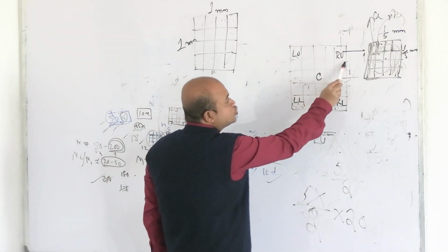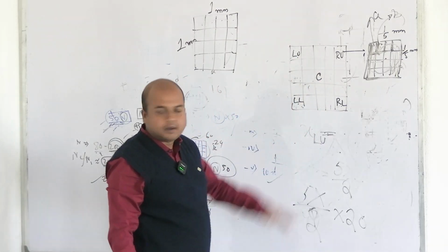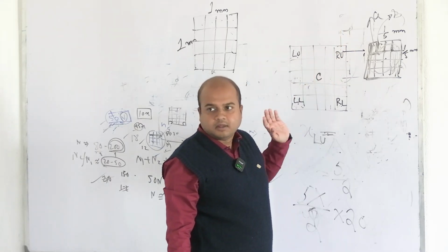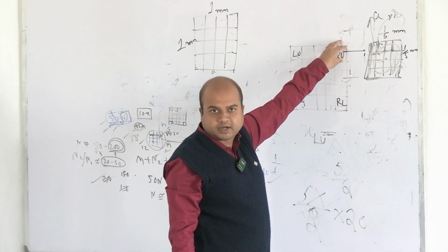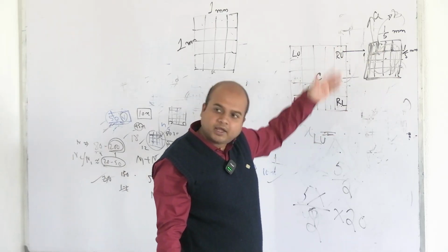Now, when you move 4 squares and reach the right upper, you already know I have moved 4 from the left upper, so it has to be right upper. But you also confirm that to the right and the upper side there are triple lines, and on the left and the lower side are the identical RBC squares. Then count similarly, and it will take time. As you have counted all these 16, again rule of L, again counting.